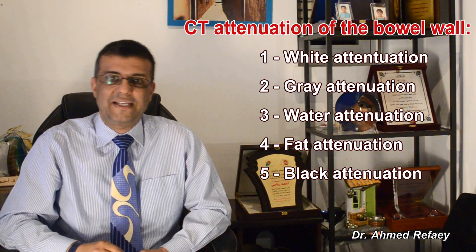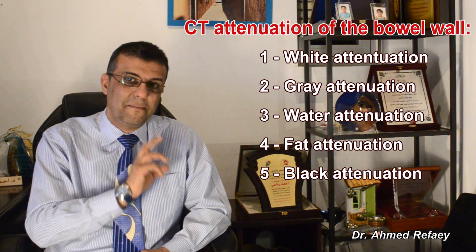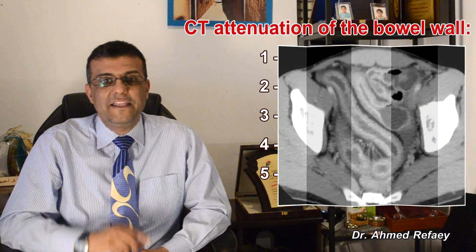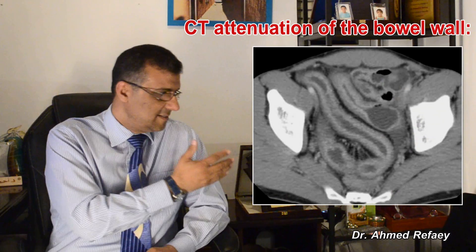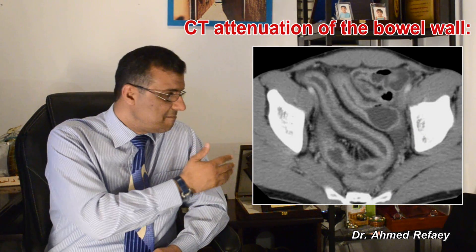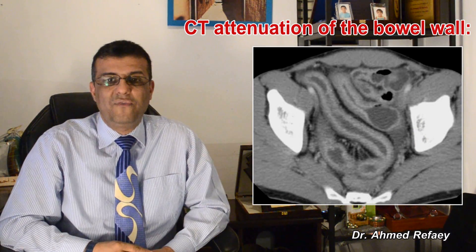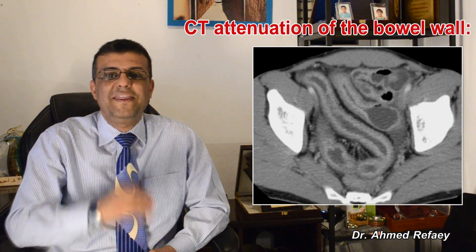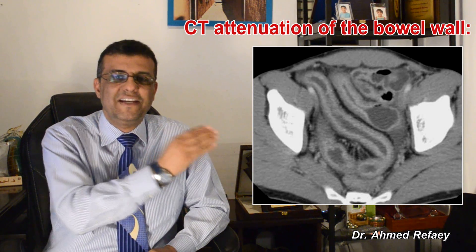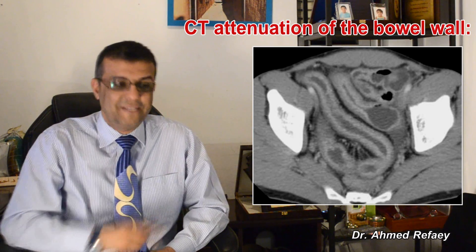The first case is a case of Crohn's disease. Here there is marked enhancement of the wall of the small bowel with the same enhancement as the adjacent external iliac vein, as you see. The second case is a case of ulcerative colitis, showing thickening and enhancement of the wall of the rectosigmoid to the same attenuation as the external iliac vein.